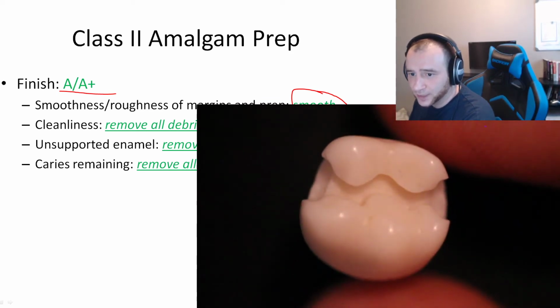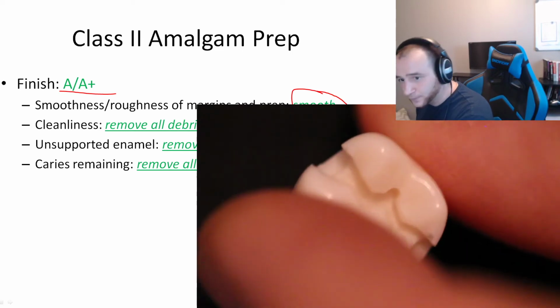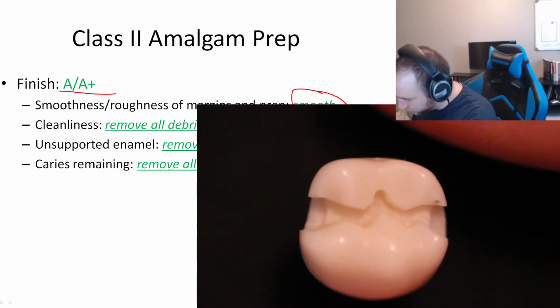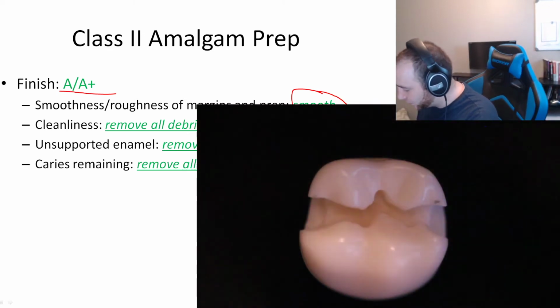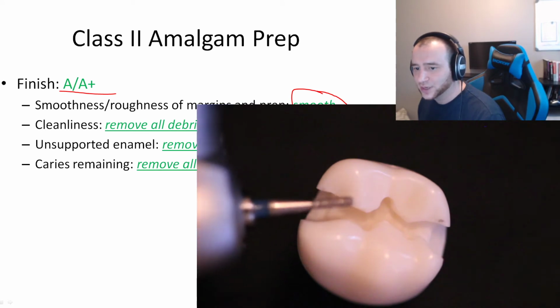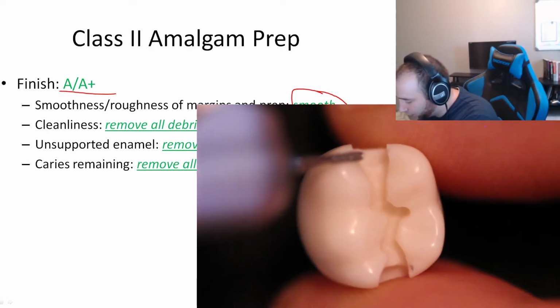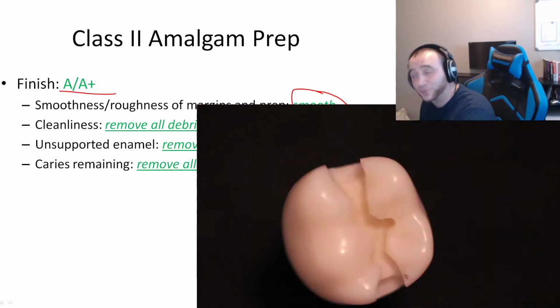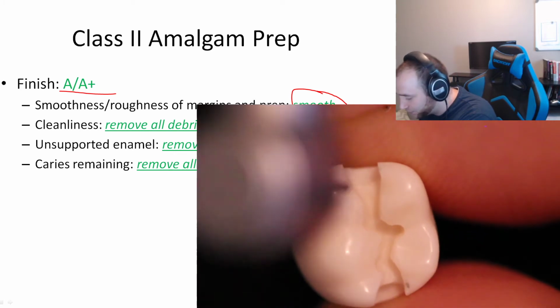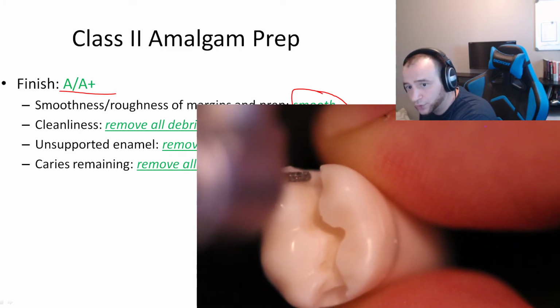So again, let me get that tooth with the acute angle here. Okay. One way to do it, as I mentioned before, I like to do it with the 245. The reason I like the 245 is that I don't get any roughness with it. So what I would do is put a fender wedge. That's my first step, because the fender wedge will protect the adjacent tooth. Then I would put my burr all the way, the entire wall.